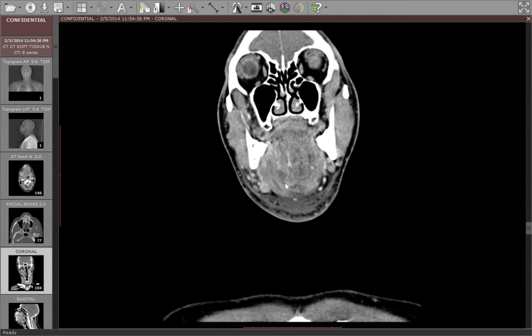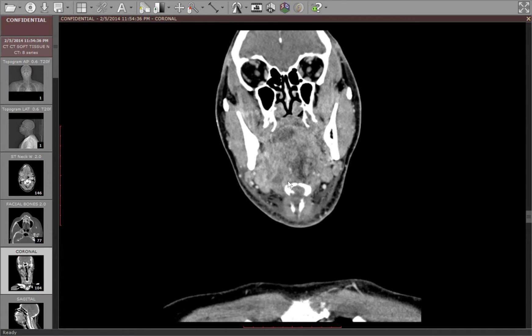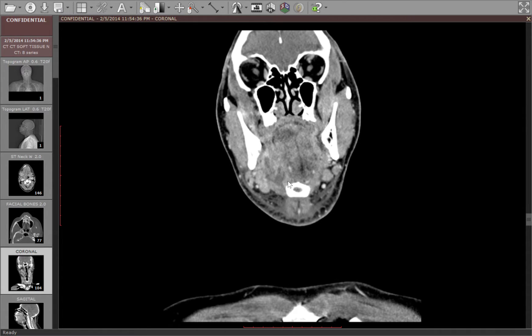These are fluid collections — they're rim-enhancing and they're abscesses. Don't expect them to be round all the time. There are a lot of muscles in the floor of the mouth — the hyoglossus muscle, the genioglossus muscle — and they divide the floor of the mouth into sections. So you can often get these kind of elongated fluid collections, but they are still abscesses even though they're not round.